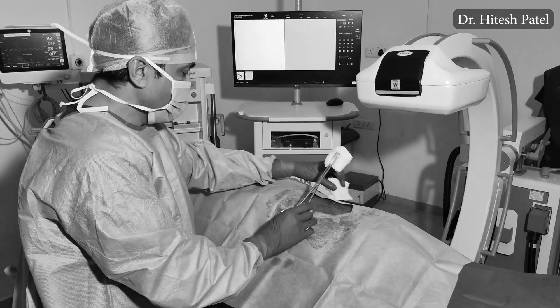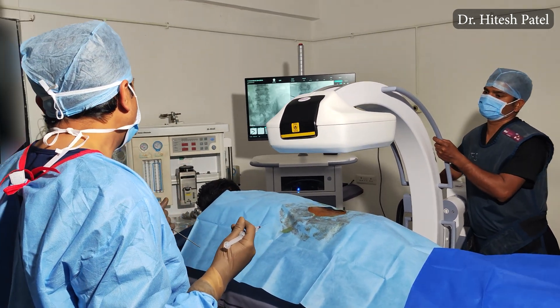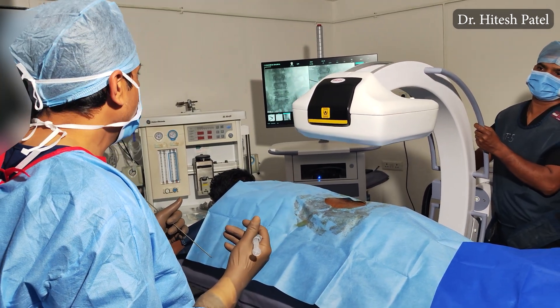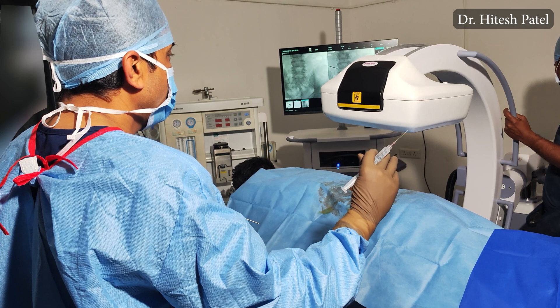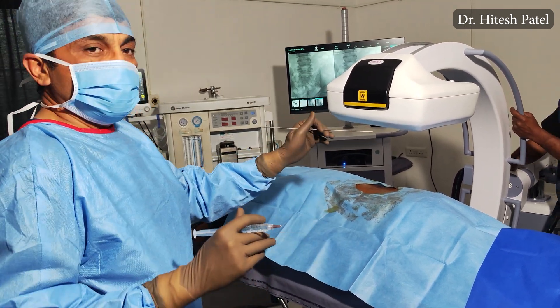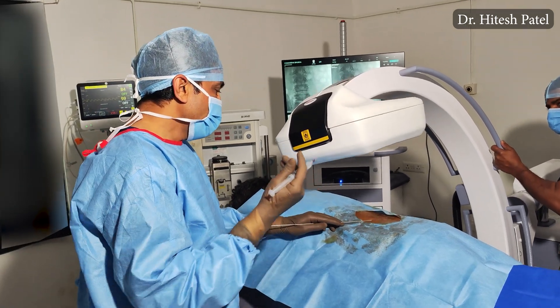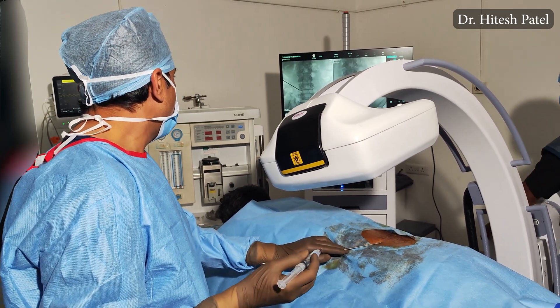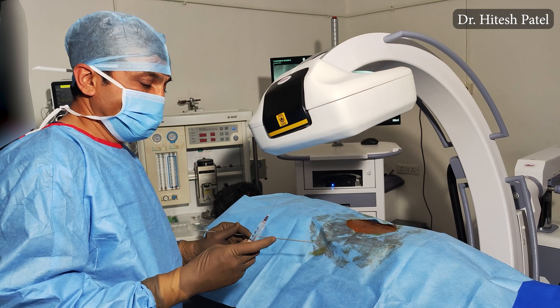We have done the painting with sterile precautions, which is important to minimize complications like infection. Do the painting and draping as you would in surgery. In the AP view, the spinous process should be in the midline. Once the spinous process is in the midline, we can tilt caudally or cranially to get the end plates parallel — the squaring of the end plates. Here we have got the squared end plates. Once the end plate is squared, we tilt towards the left side in this case to open up the foramen. If the foramen is not open enough, we can tilt more towards the left — the pathological side — to open it further.